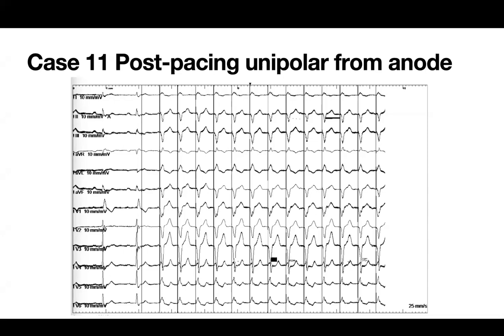I do this every time, because if the ring has a nice threshold, and I even measure the threshold of the ring, and I'm not perforated, I think it's actually a really great implant. Does anybody else use the ring testing to know if it's in or not? I love doing this to compare the tip versus ring morphology. It somehow makes me feel better all the time. Yeah, that's the same thing.